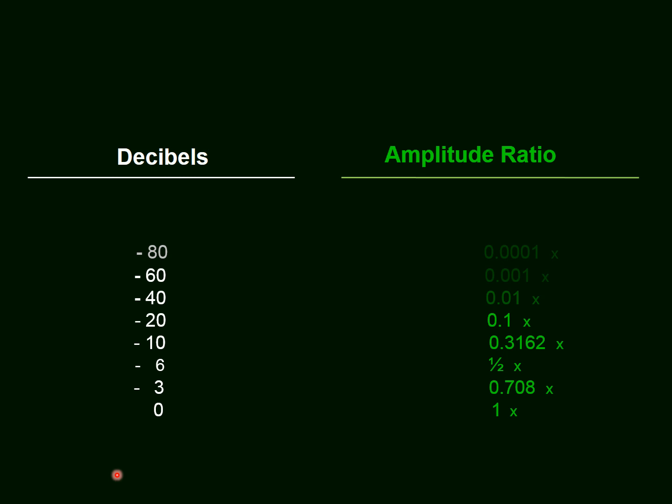On the right side we see the decrease in amplification, and again with small numbers it's understandable, but when it comes to the greater amounts of lowering the amplification, these numbers are beyond our understanding and beyond any practical use in standardized echography.